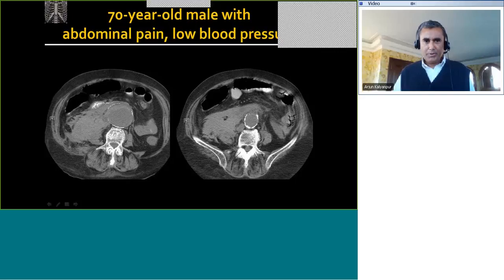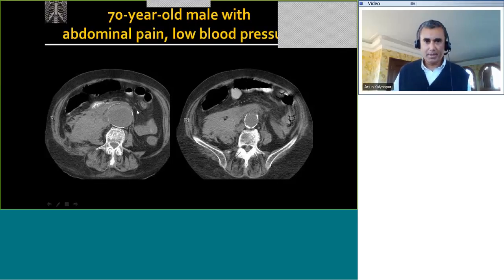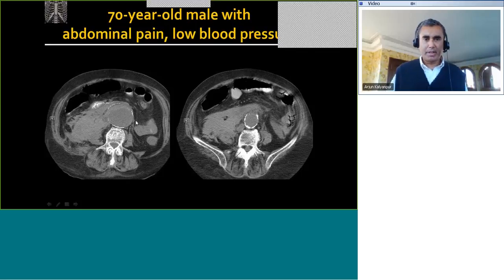The importance of the hyperdense crescent lies in the fact that if this hematoma were unruptured, seeing the hyperdense crescent by itself is a poor prognostic sign, as it can indicate impending rupture. So if we see a large abdominal aortic aneurysm with a hyperdense crescent, this means there is acute intramural hematoma and the patient is at risk for impending rupture, and therefore needs to be monitored very closely.